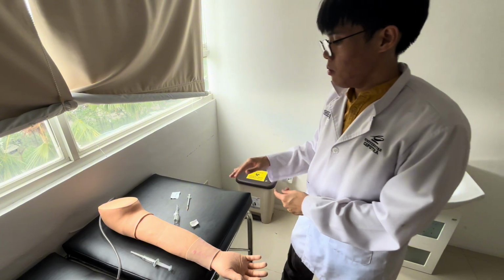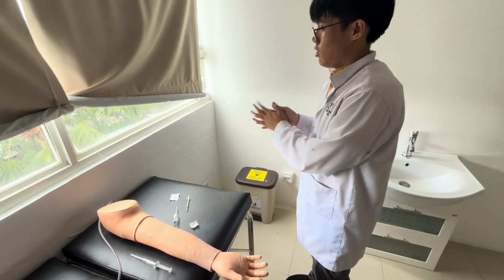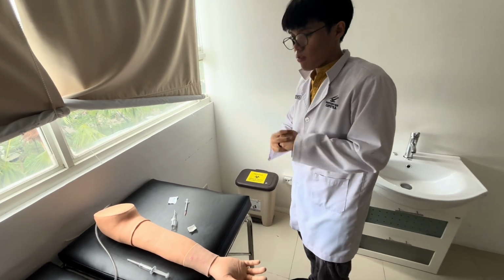And then obviously after you dispose of the syringe, remove your gloves and do 6-step hand washing. Done.